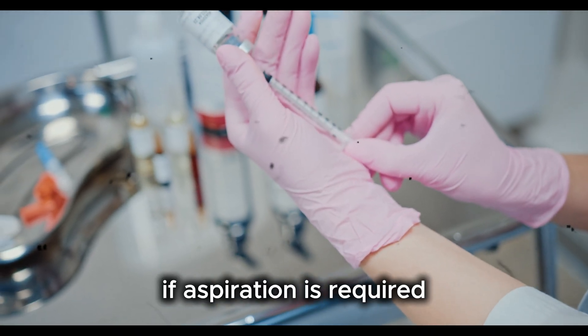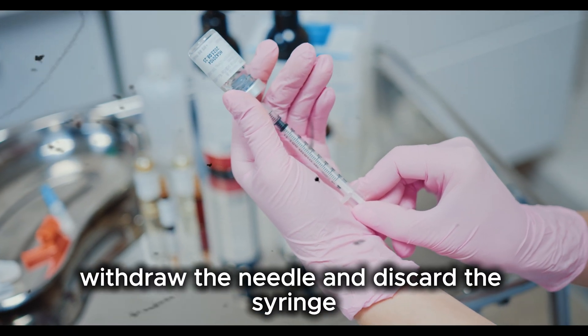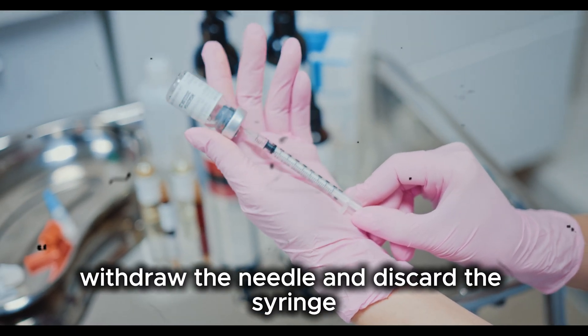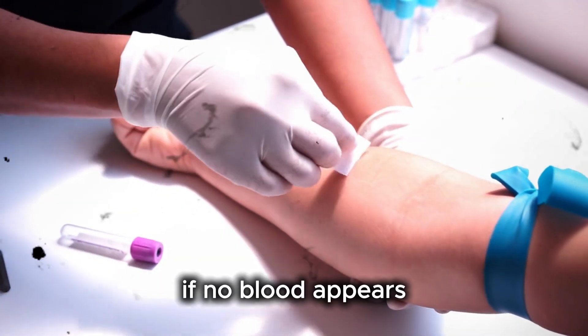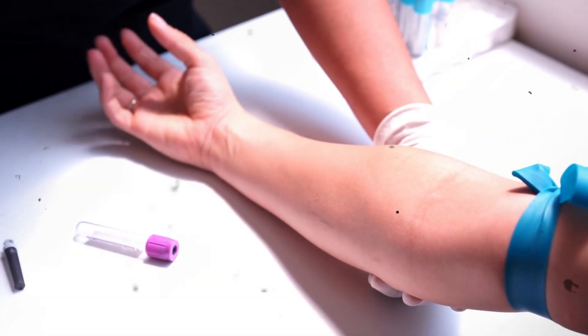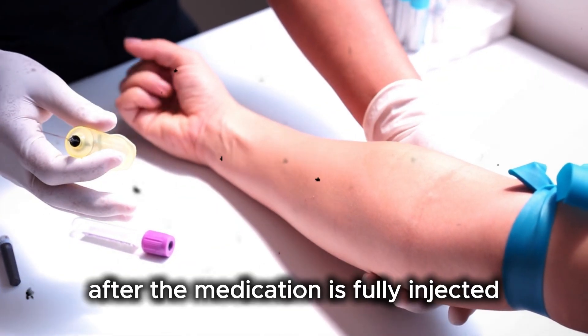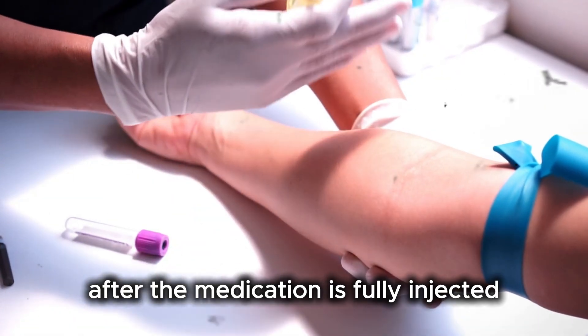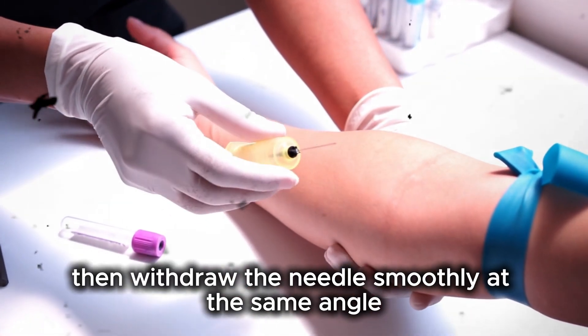If aspiration is required, gently pull back the plunger. If blood appears, withdraw the needle and discard the syringe, then prepare a new injection and choose a different site. If no blood appears, inject the medication slowly and steadily. Injecting slowly reduces pain and tissue damage. After the medication is fully injected, wait a few seconds, then withdraw the needle smoothly at the same angle.